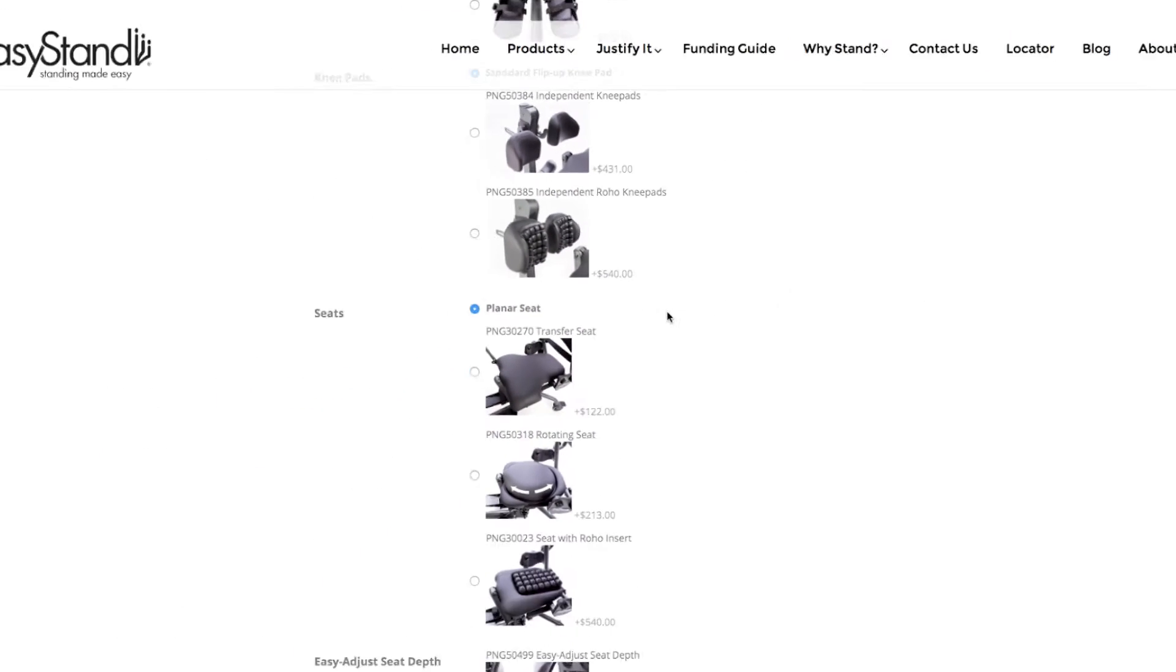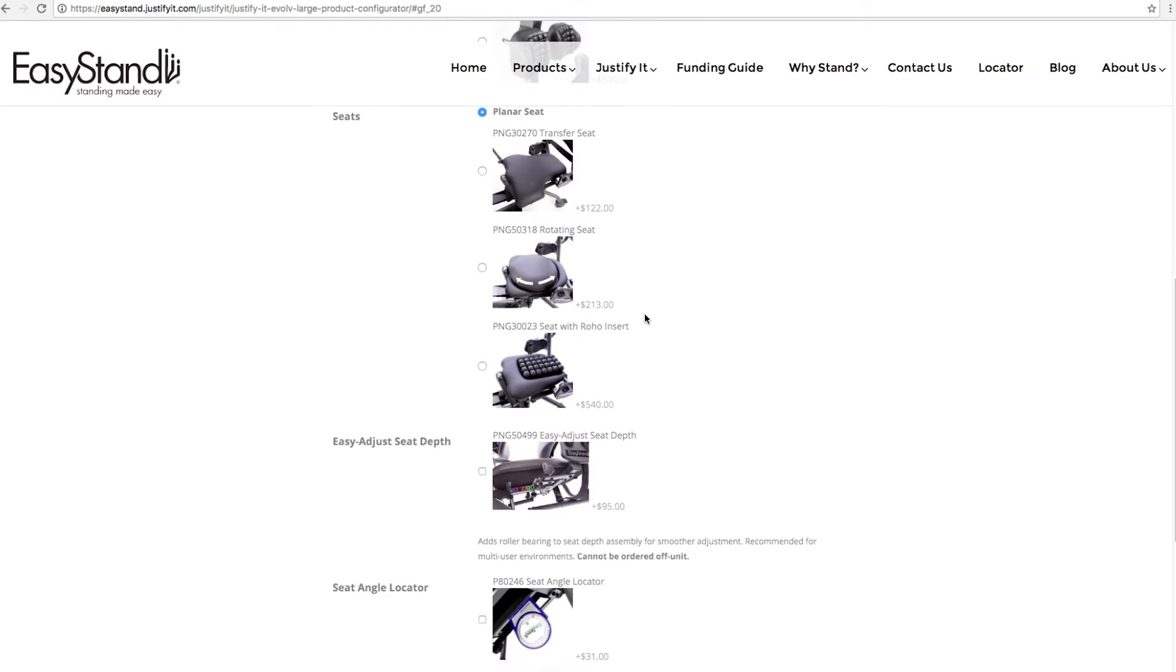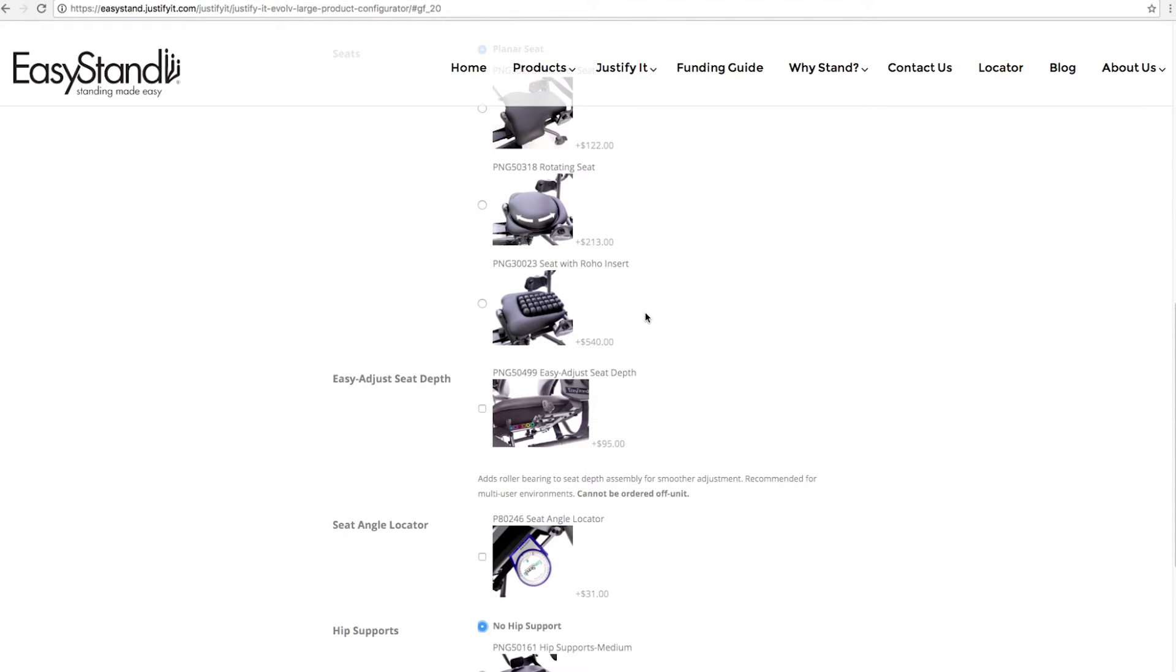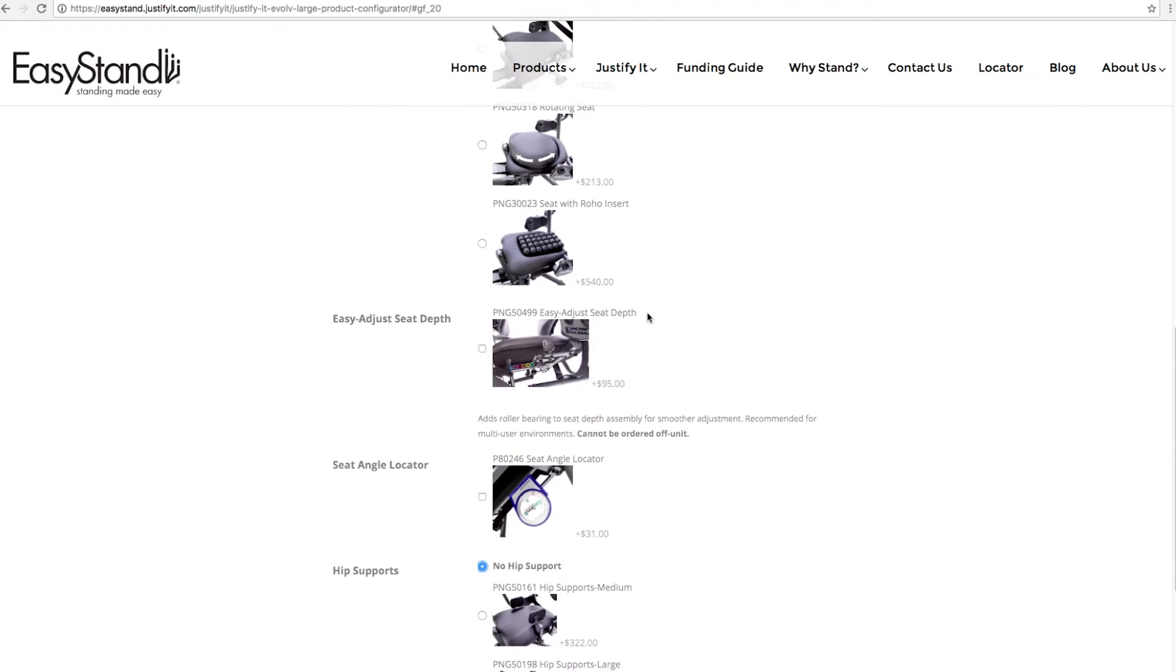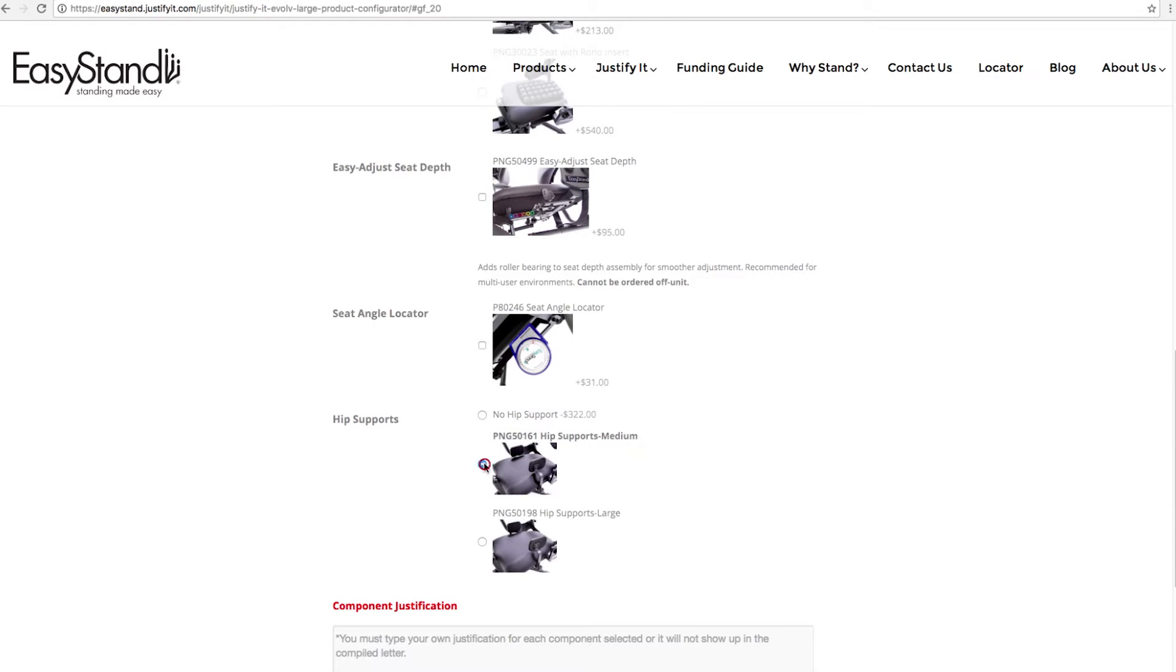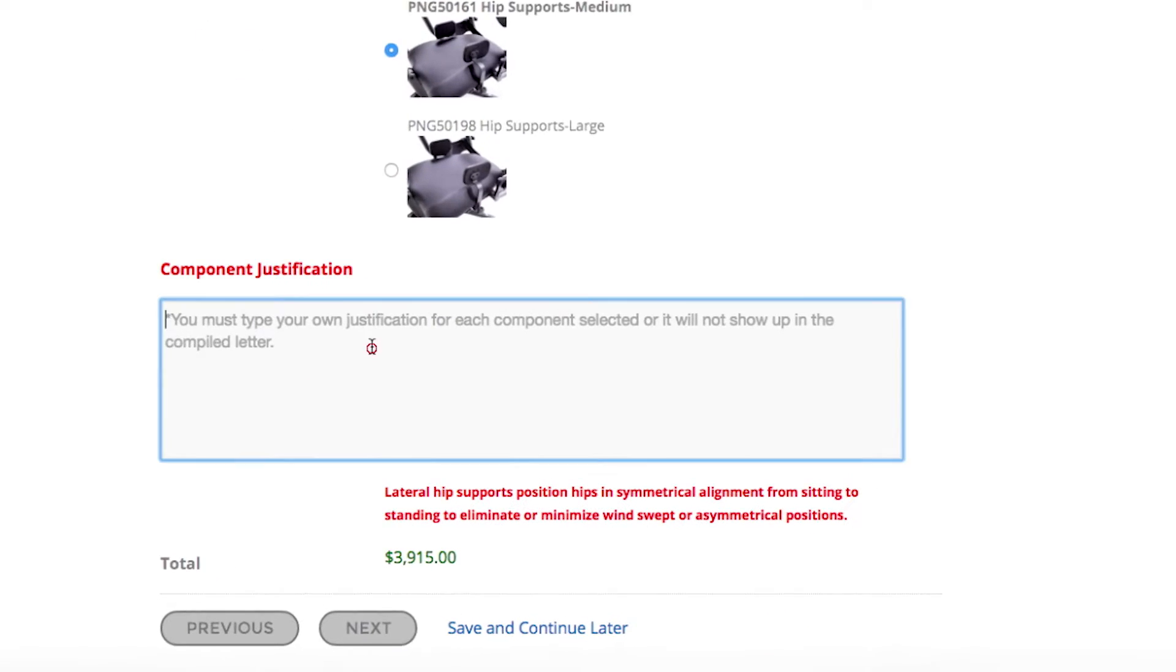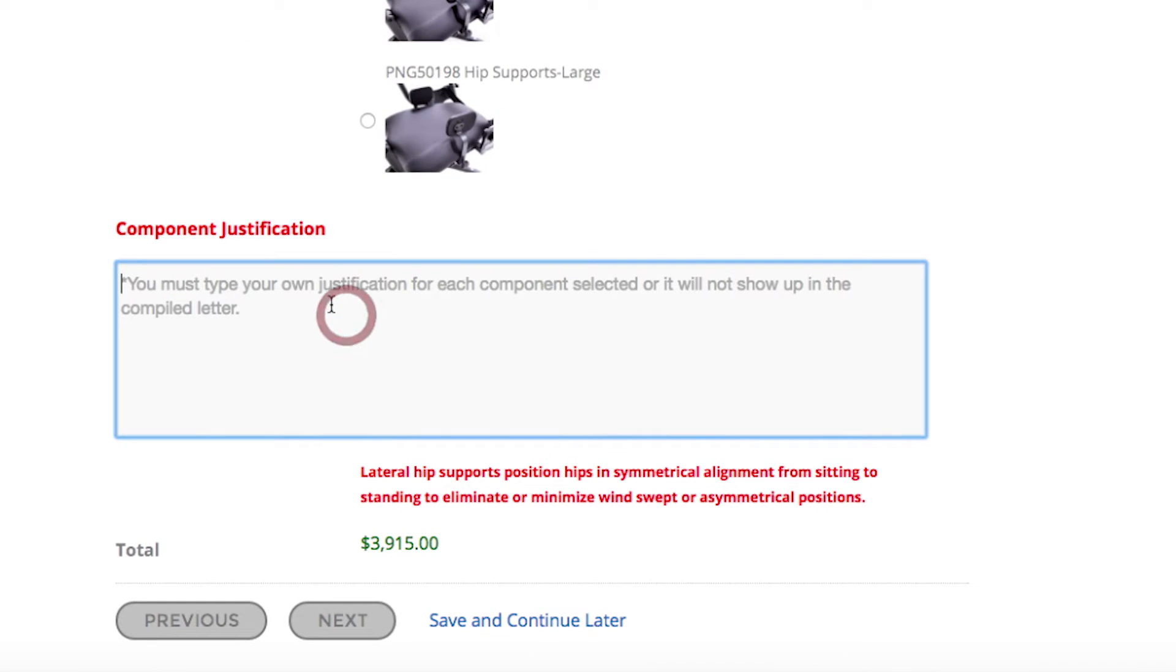For instance, hip guides are not included in the base price of a stander, but your clients need them to stand. When you select hip guides, a prompting box pops up, complete with an example of justification.